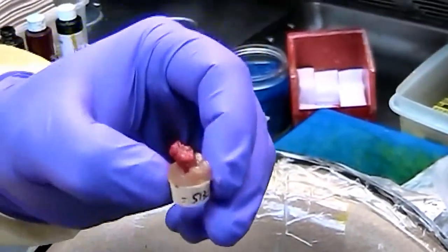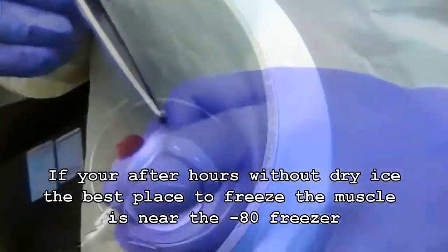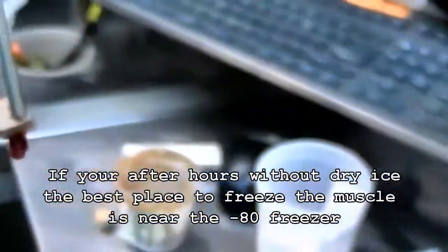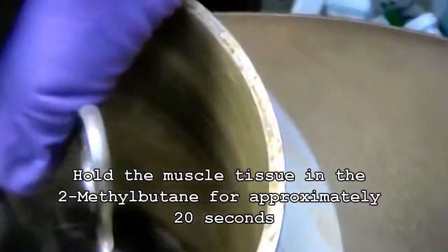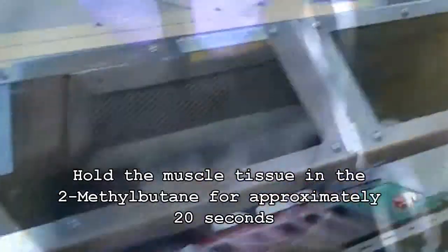So the gum's going to hold it. Now, as you can see in there, see that white rim? That's what you want. To hold it like this, invert it. Hold on, let's get a clear close up. And then 20 seconds. 1, 2, 3, 4, 5, 6, 7.